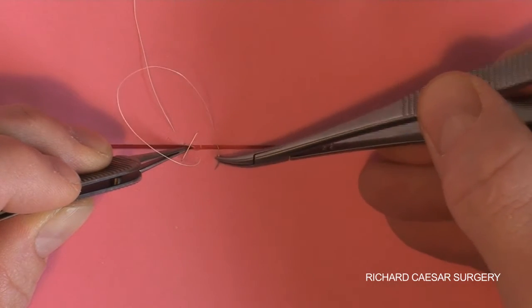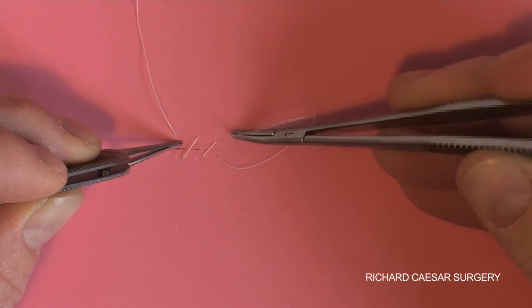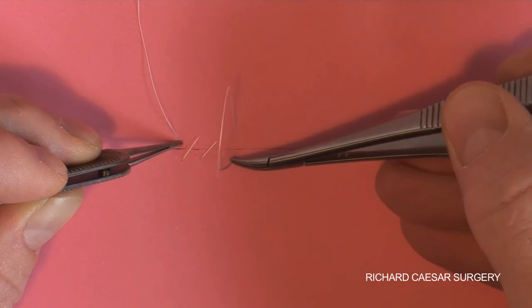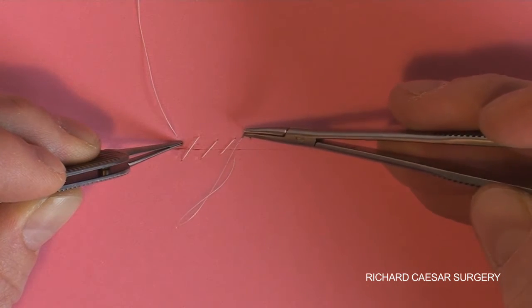Push, push, and a pull — and you've made your stitch. Another push, push, and a pull, and you're ready to go. This really is worth practicing away from the patient.